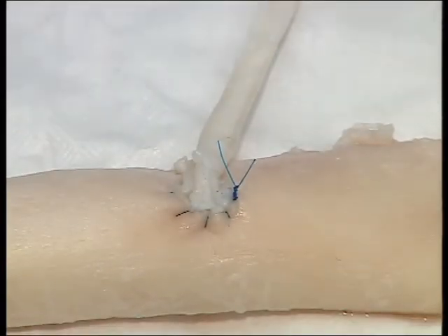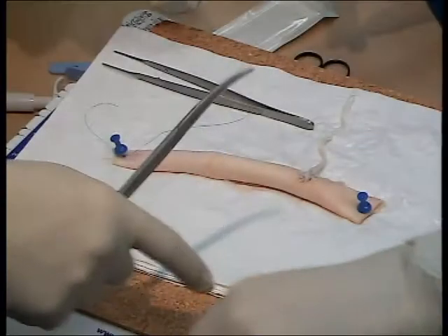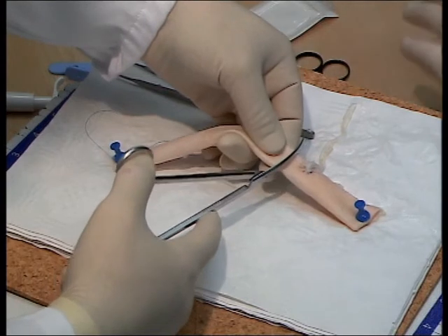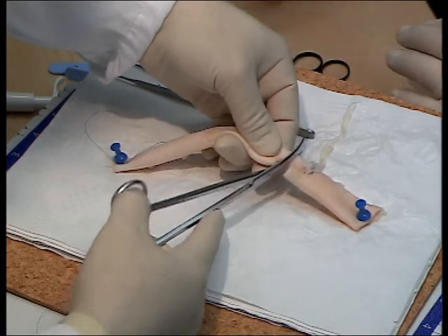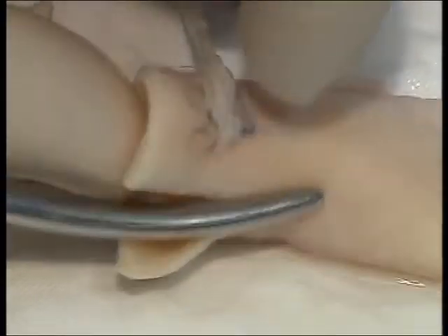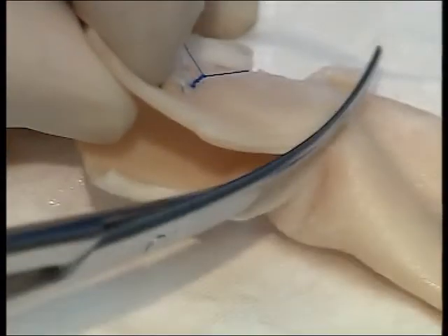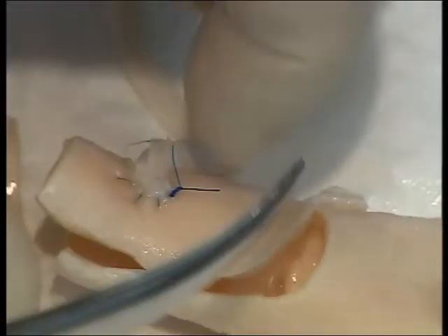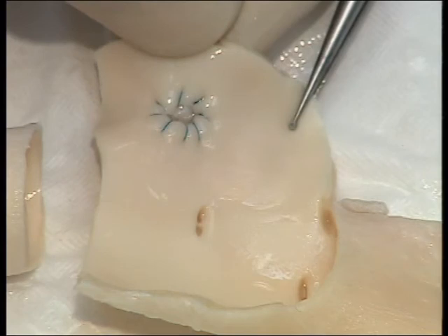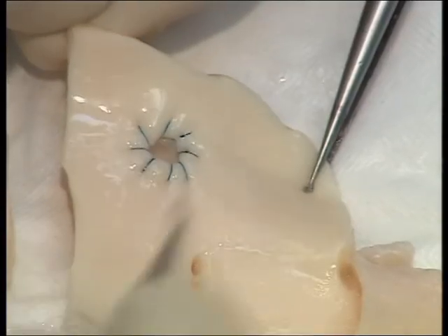Check the external appearance of the anastomosis and then check the interior appearance by transecting the aorta and opening the anastomosis out. Check for even spacing of full thickness sutures and take a probe, pass it up the conduit and confirm patency.